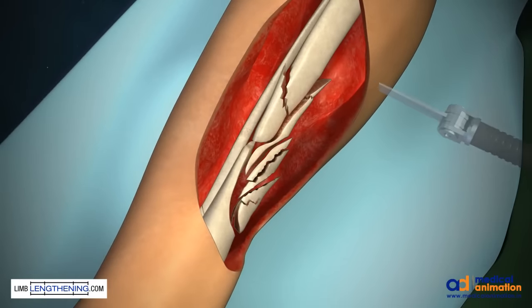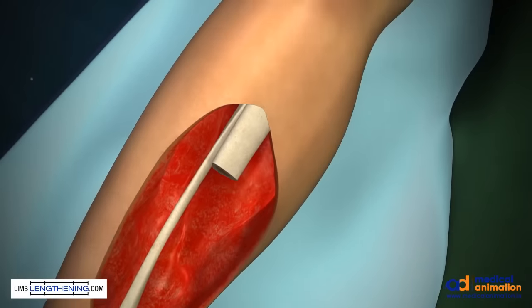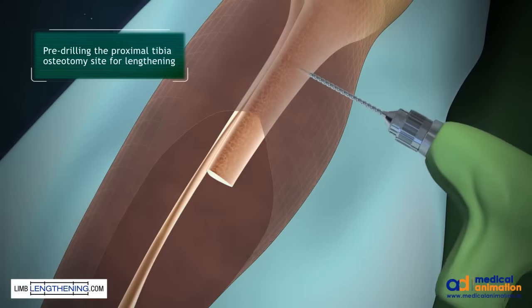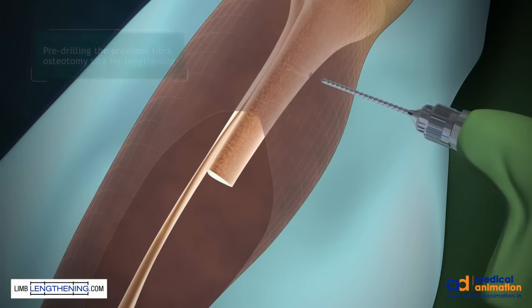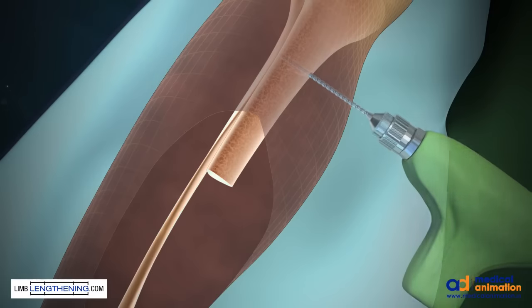The first part of the procedure is removing devitalized bone and creating orthogonal cuts of the tibia that are perpendicular to the anatomic axis since we're doing a bone transport. After the bone fragments are removed, a small incision is made at the site of the lengthening, and a 4.8 millimeter drill bit creates the holes for the osteotomy.